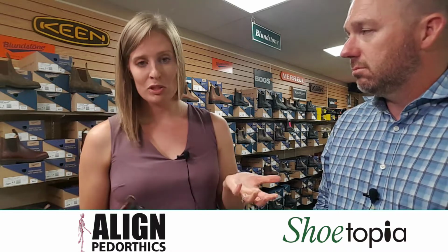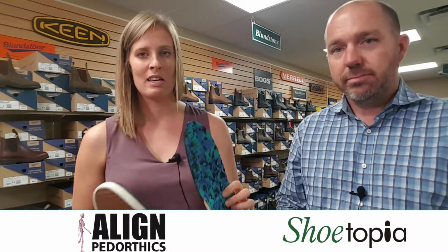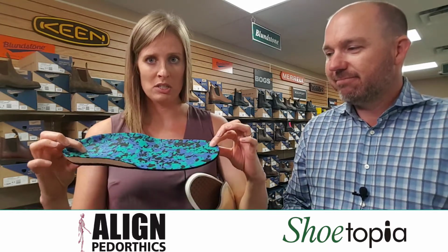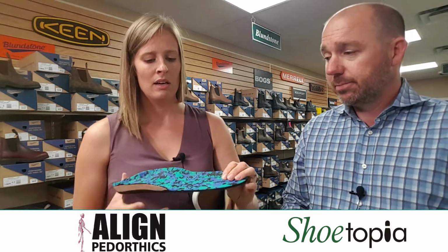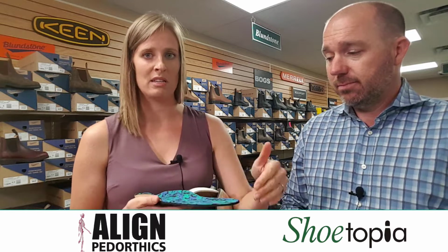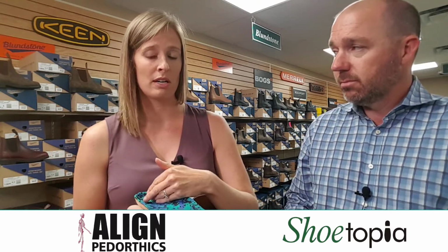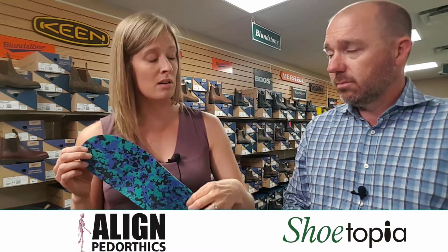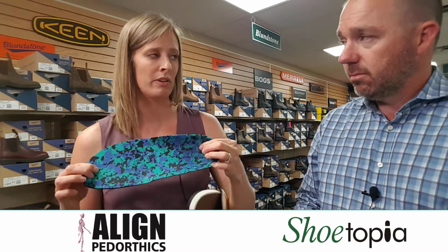So my go-to pair of orthotics would be this full-length orthotic. And so what this has here is full front to back coverage. An insole of your shoe would come out and the orthotic would go in. This has the support here that you need, and it's also one piece, so you don't feel the edge of it, the end of it, like you would with some of the other shorter orthotics. The downside of this is that an insole does have to come out, so if that isn't an option in some of your footwear, it's a little bit tougher to fit in.